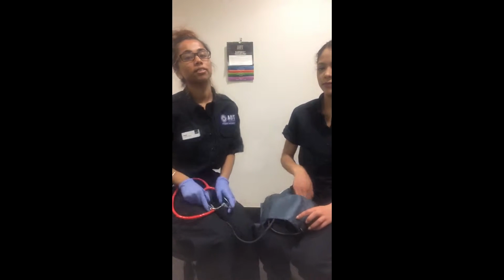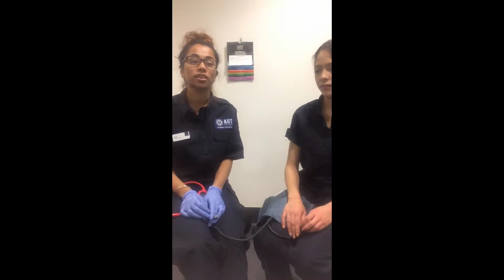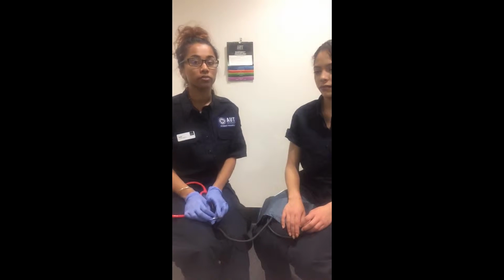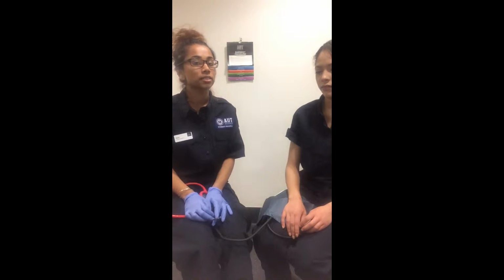So the first sound is Nicole's systolic pressure, which was 120, and the point where the sound disappeared is her diastolic pressure, which was 72. Normal blood pressure measurements are a systolic below 140 and a diastolic below 90. So Nicole's falls roughly within that range. A patient is considered hypertensive if their systolic is over 140 or their diastolic is above 90.